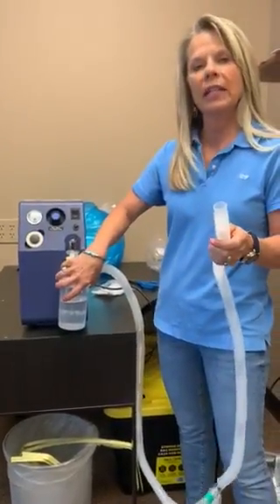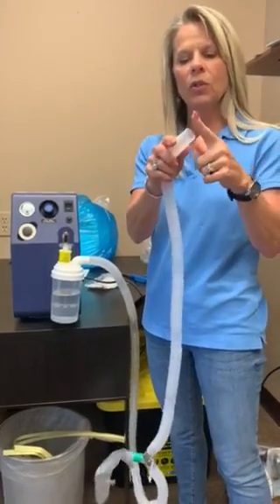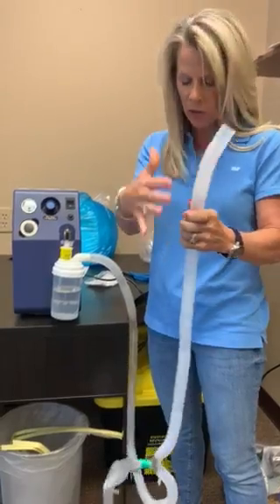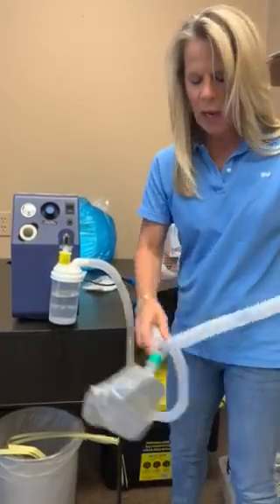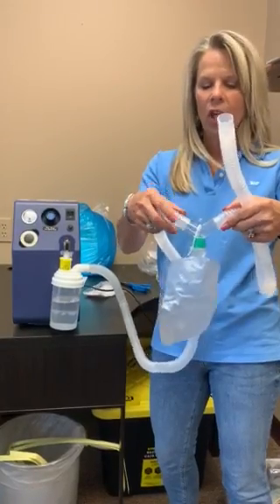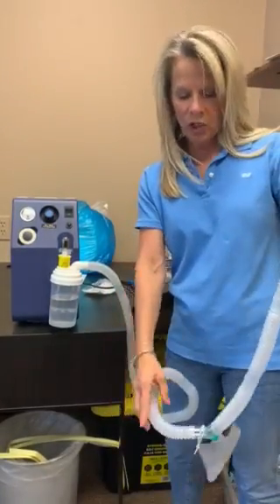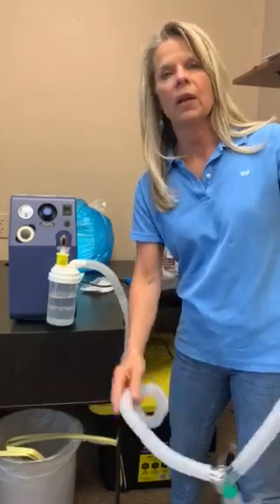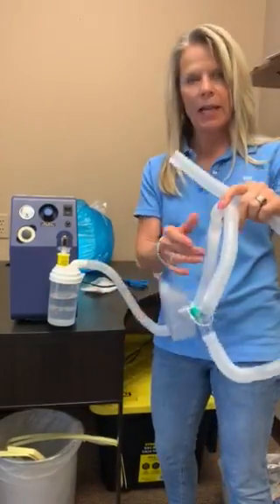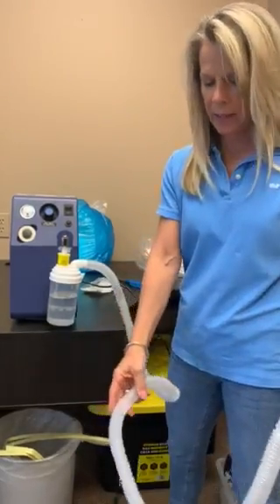Those are all the parts that you're going to need. This also attaches to the trach collar or the trach mask — you will actually have to cut the tubing that comes in the package. You are going to change this out once a month, which will be the tubing, the water bottle, the drainage bag, and the trach mask.